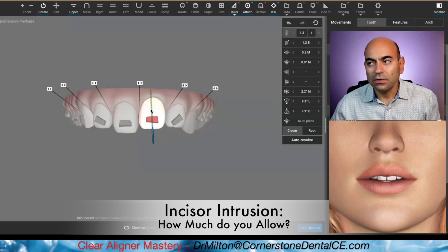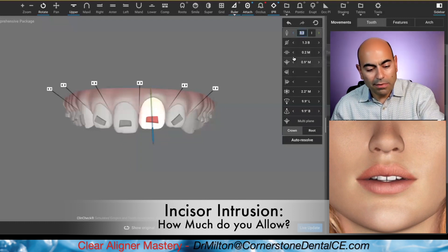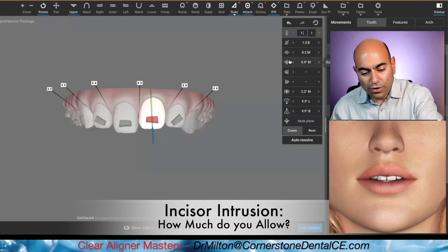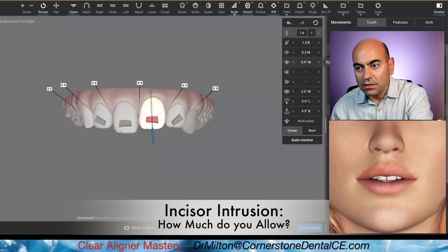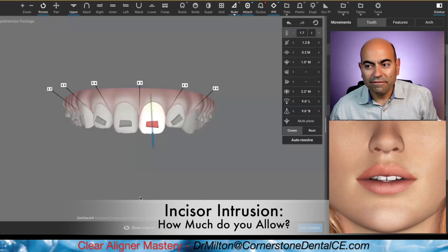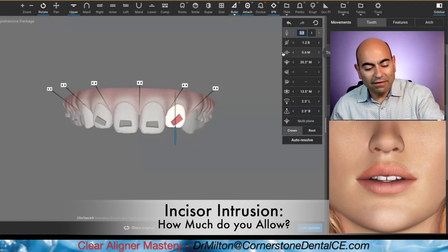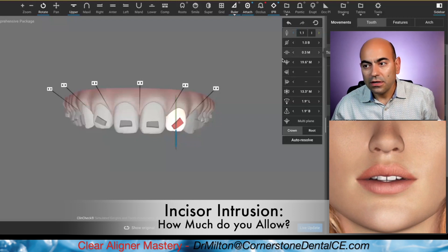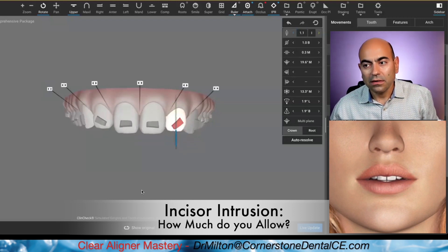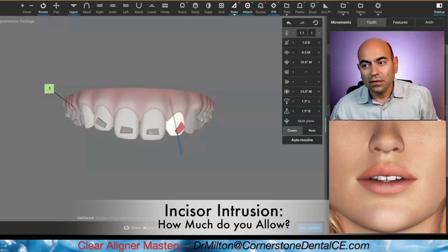Same thing here — 3.3, how about 1.6? Original. Final. Now we come over here: 2.3, we cut it by half. Let's do one millimeter here and see where it ends up. Look at that. I love it.